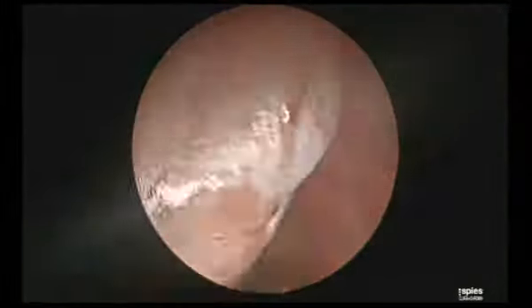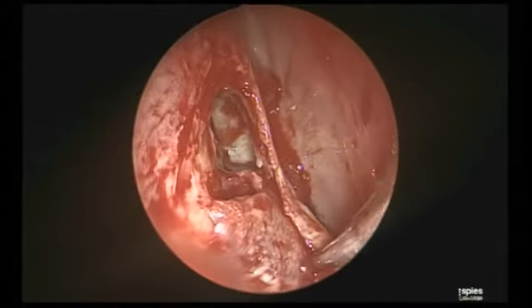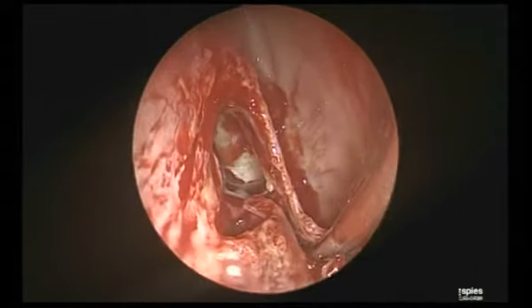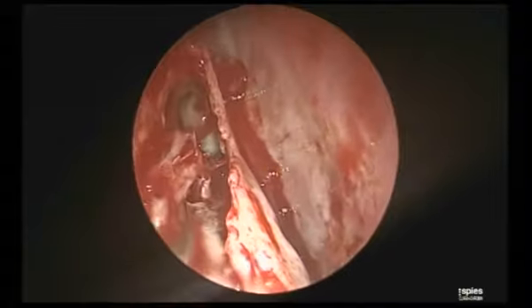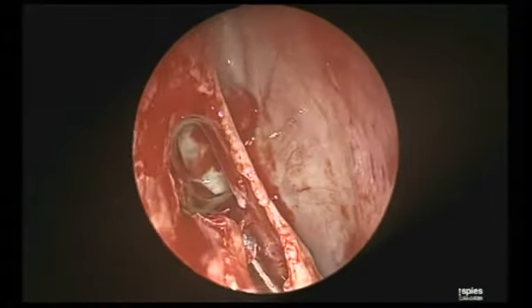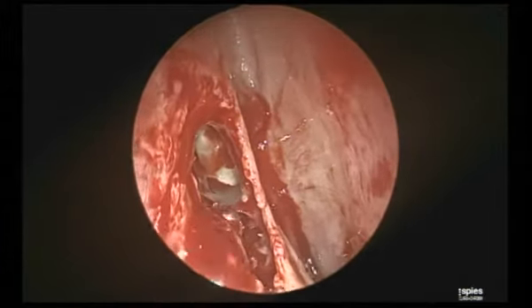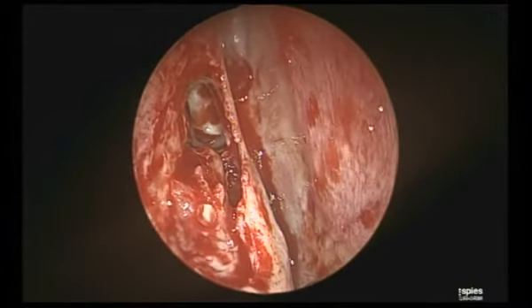Engage your probe, and go as superiorly as possible. This is possible if you have good visualization. That's how the mopping is done. See, go as superiorly as possible. Whatever is crackable behind, crack, and just press it opposed to the posterior wall of the bulla, pressing it laterally to the lamina. Go up, just opposed to the posterior wall of the bulla. See, I have fractured a little bit. I will remove this with the debrider. Give me.